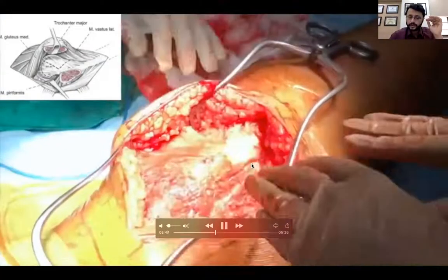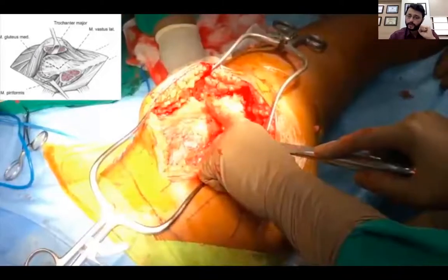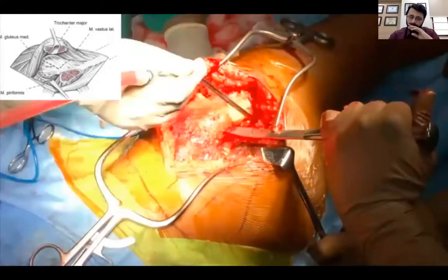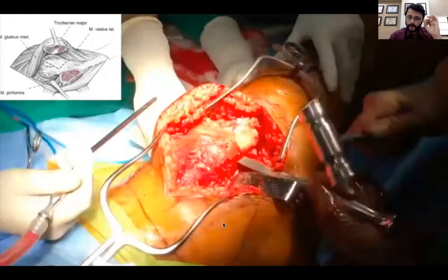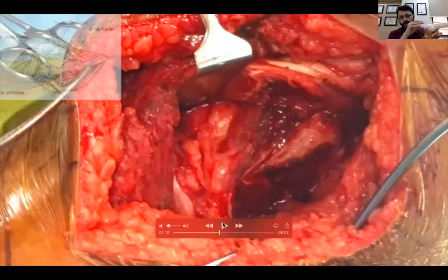So what I do is take the saw initially and use big thick curved osteotomes, 15 to 20 millimeter, and then direct them anteriorly like this. You can see that? So that it remains flush with the shaft. It's a sliver of bone about 1 to 1.5 centimeters thick, like this, right? And we have the digastric flap, which is the gluteus medius here and the vastus lateralis here. Once I osteotomize, I will flip this entire thing anteriorly. The only thing which prevents this from going anteriorly is the tendon of the gluteus minimus. Gluteus minimus is the only tendon which is tenotomized when I do the trochanteric flip.